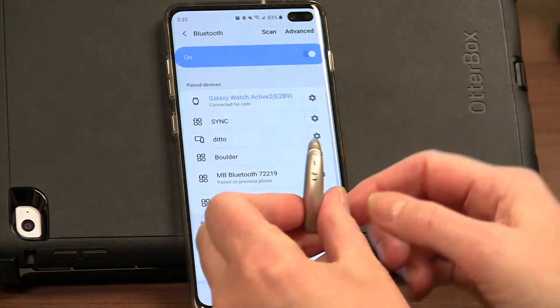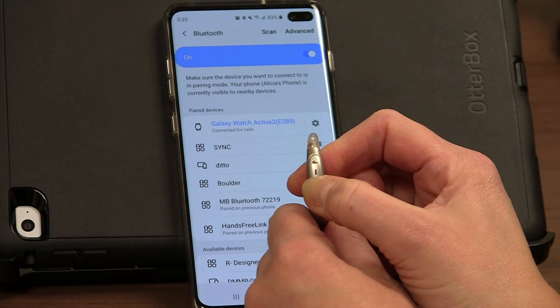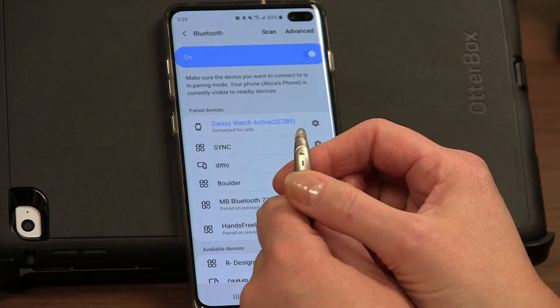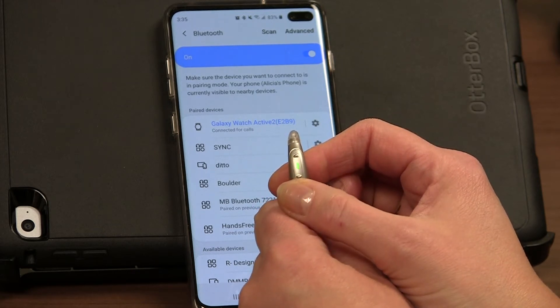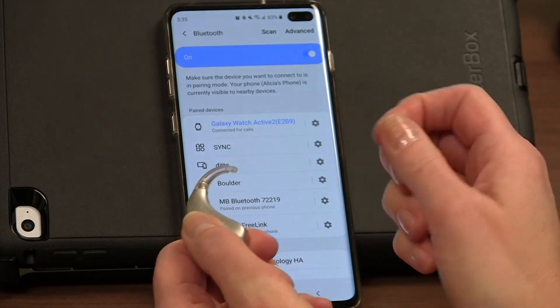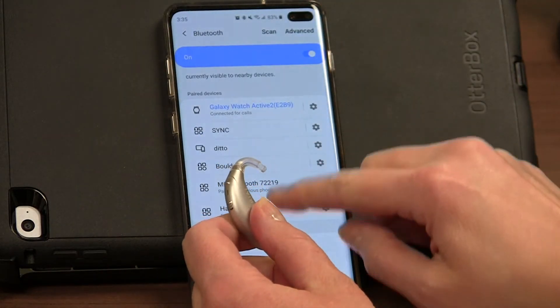Additionally, if you have rechargeable batteries you can press and hold to turn it off, and then press and hold to turn it back on. If you have disposable batteries, you're just going to open your battery door to turn it off, then close your battery door and that will turn it back on.